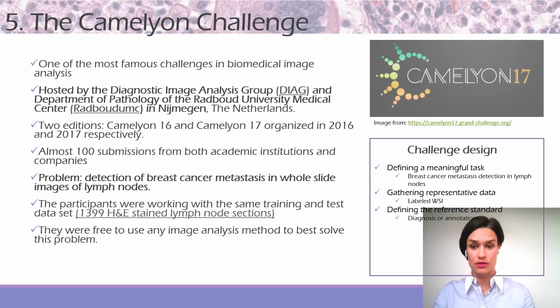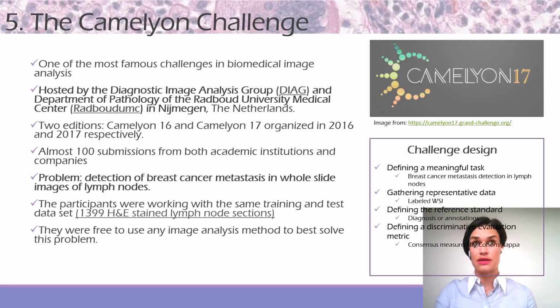That was the diagnosis of a pathologist and their annotations. And a discriminative evaluation metric needs to be determined. In this case, the consensus of the algorithms with the pathologist's input was measured by Cohen's kappa. And the participants are required to write a peer-reviewed publication.